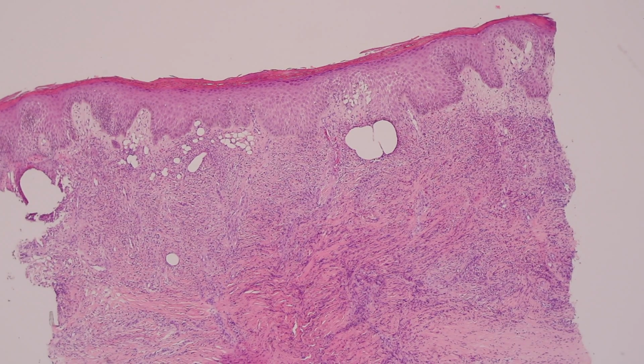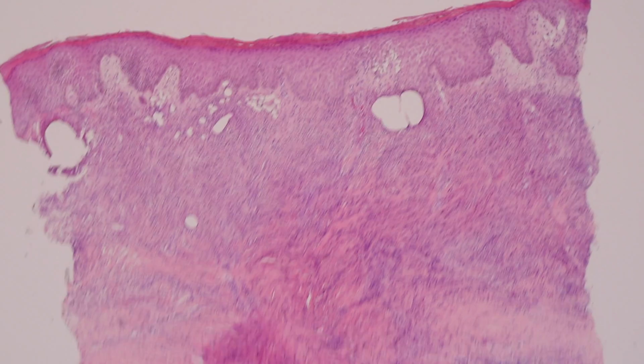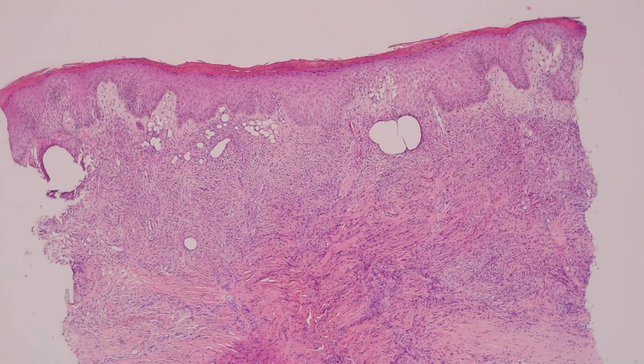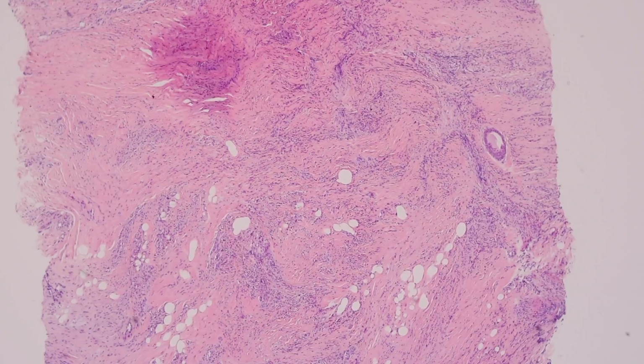EED, or Erythema elevatum diutinum, also has a fibrosing vasculitis, just like we saw there in that last case of granuloma faciale. The difference in EED, though, is that it's usually on the hands, the feet, sometimes the elbows, and it makes these kind of larger, erythematous red or violaceous, firm nodules. And the reason is because in this entity, there's a lot of fibrosis.